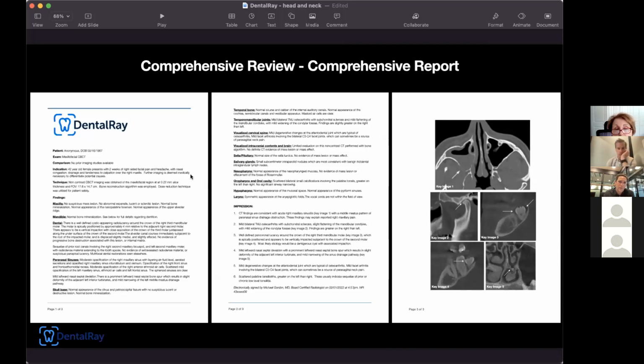And I won't read through all of this, but this basically just goes through, as we did in picture form just now, each anatomic subsite, and it's specifically looking for those pertinent negatives. Do I see the normal recesses? Do I see the normal fat plane? And it's talking about positive things that are there that you want to be there, and pertinent negatives, things that aren't there that shouldn't be there. And it's going through every anatomic subsection, and then there's an impression.